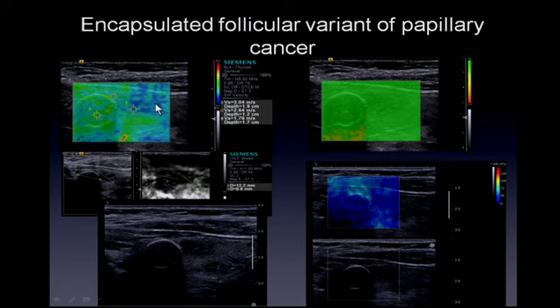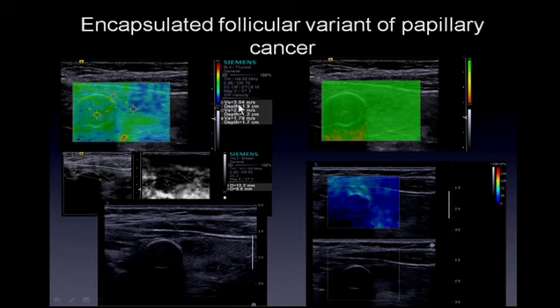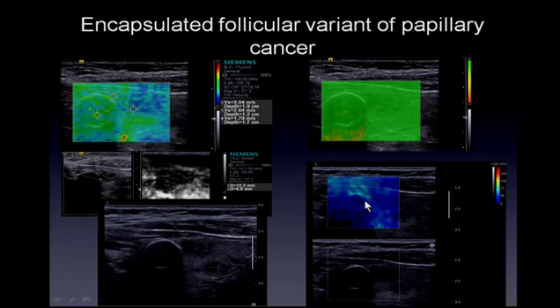On shear wave imaging of these lesions using a Siemens system in meters per second, the velocity within the lesion is approximately 3 meters per second. On the supersonic system, the similar reading converted to kilopascals is approximately 40 kilopascals. Based on these numbers, we would have predicted this to be a benign lesion.